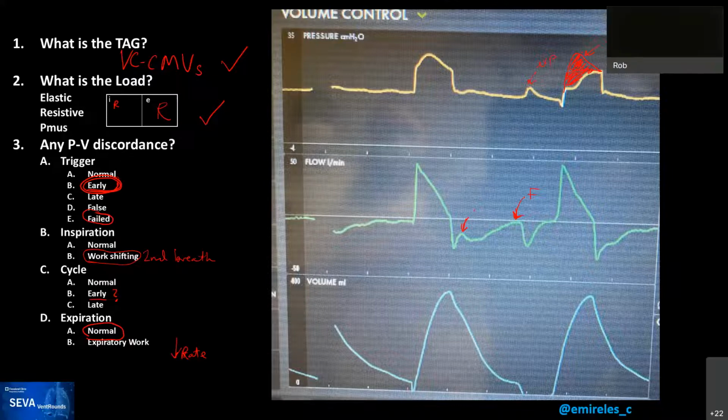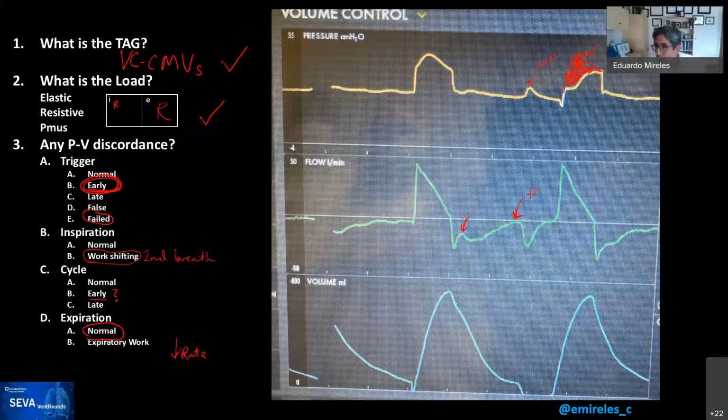Okay, so we have a couple of questions from the team. The first one is Dilip asking us if this should be CMV, IMV, or DS. Rob, any comments there?